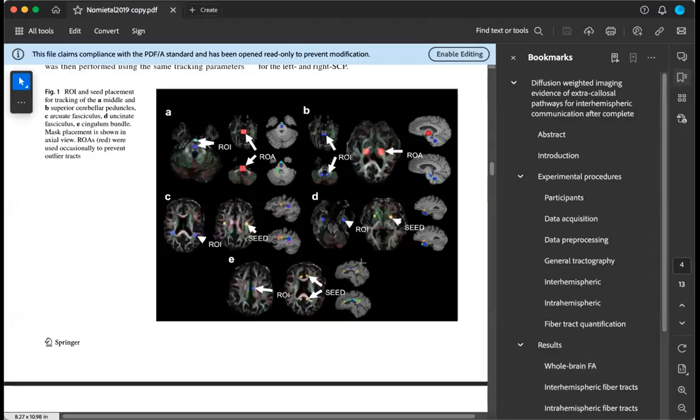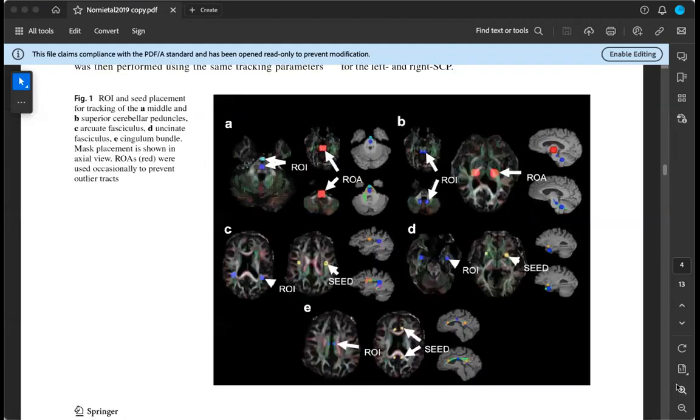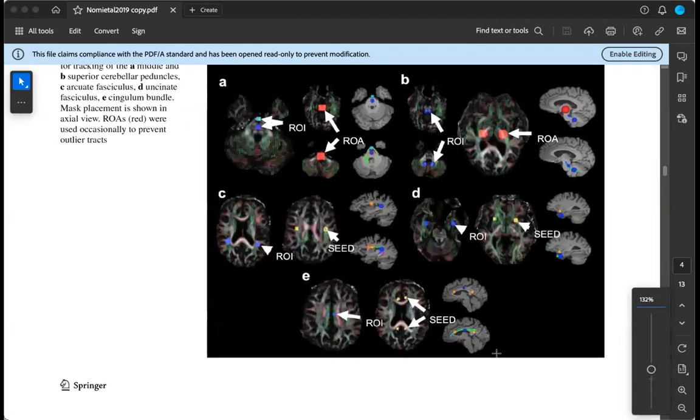Any questions? We just started tracking this. It's really cool. It's a lot to learn. This is the cingulum, so it's right there, right above the ventricle, the lateral ventricle. Is this from your paper? This is 2019. Go back to PSI.